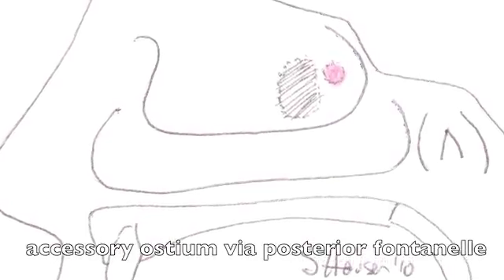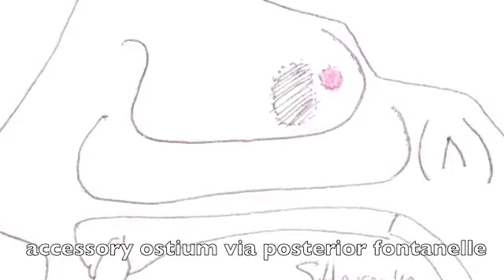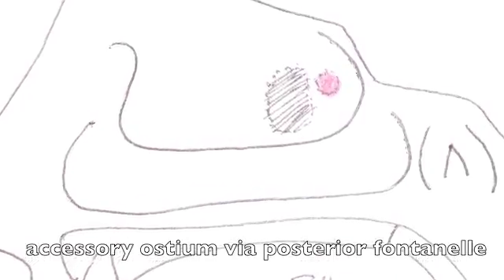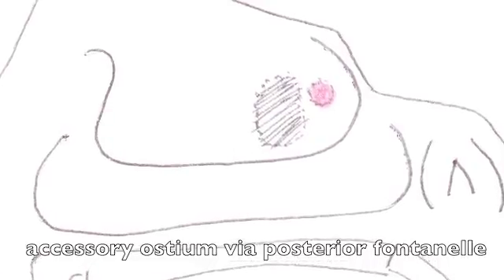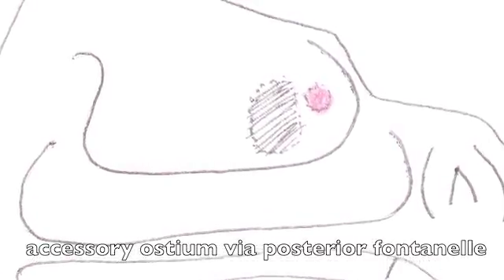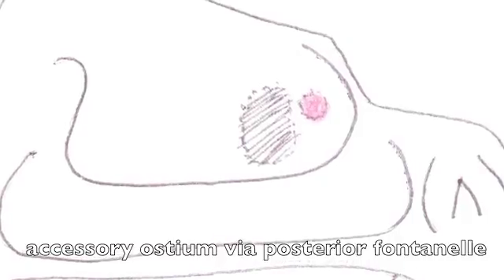To ligate the sphenopalatine artery, I start by making a hole through the posterior fontanelle of the patient's maxillary sinus, finding then what I term the corner, or the back wall of the maxillary sinus, where it joins with the side wall of the nose. In axial view, looking from above, we now see this corner, which has the opening to the maxillary sinus at the inferior aspect of the view.